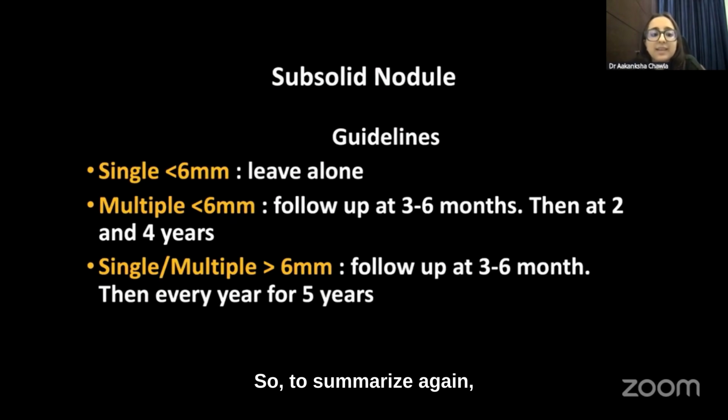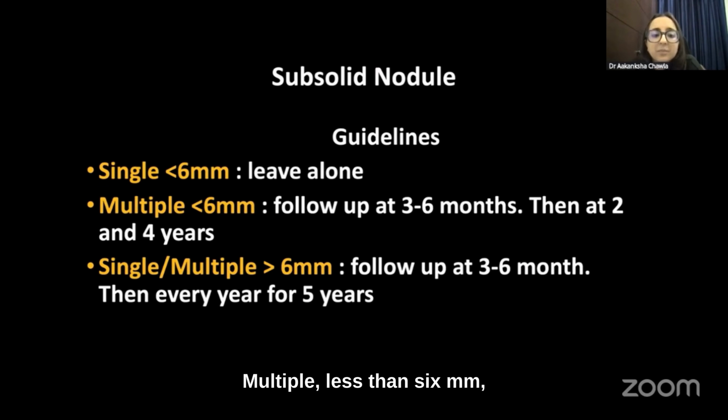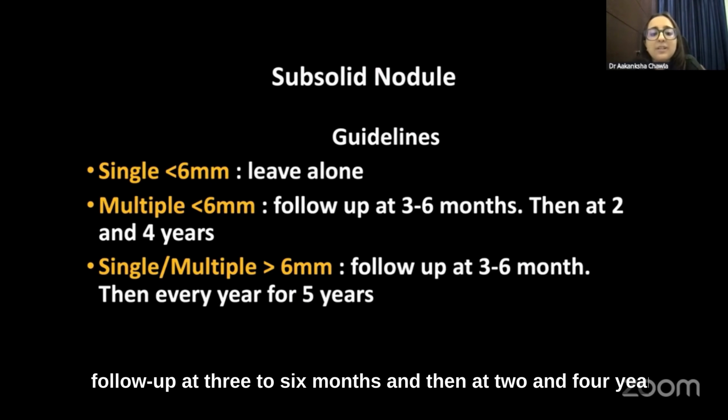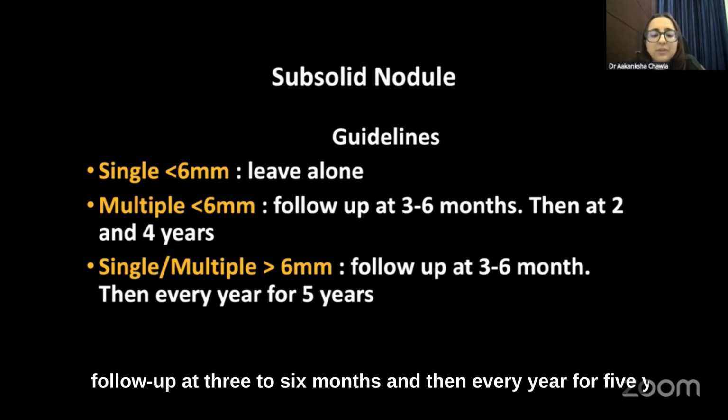So to summarize again, single less than 6 mm subsolid nodule, you can leave it alone. Multiple less than 6 mm, follow up at 3 to 6 months and then at 2 and 4 years. Single or multiple more than 6 mm nodules, follow up at 3 to 6 months and then every year for 5 years.